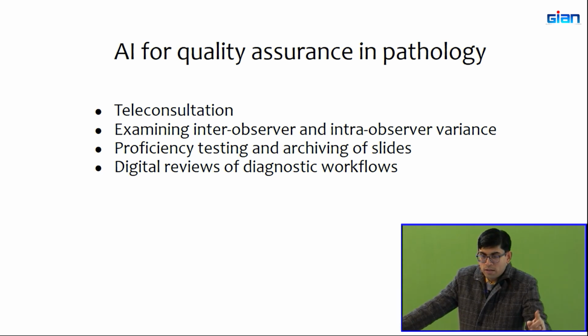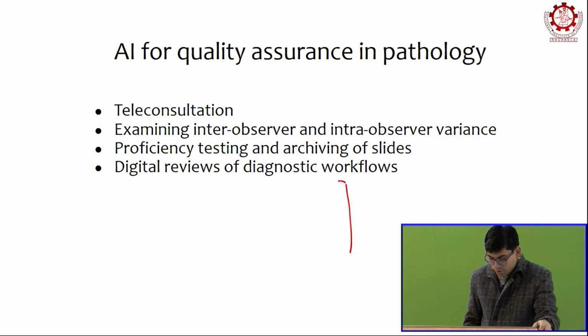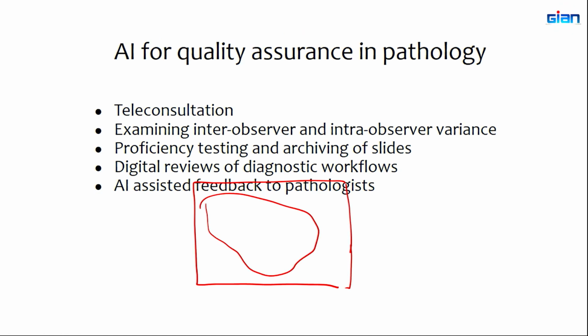Now, what is done in a lot of these digital pathology software is, while the pathologist is looking at different regions of the slide, I can try to illustrate that here. So this is your computer screen. Let's say you have the whole slide image here. Let's say the pathologist starts from here, and then they move here, and then they move here, come here.